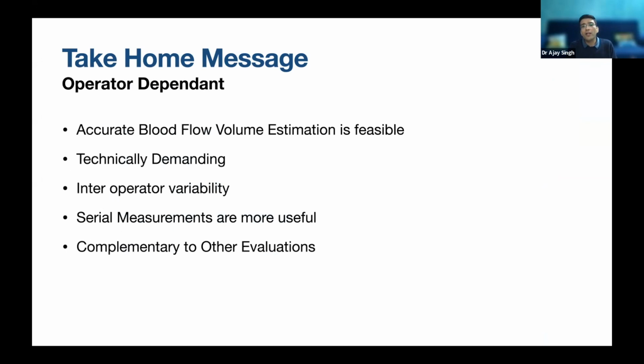And when you are recording this in the patient file, we have to record where exactly you have done this measurement, and you need to keep doing it at the same place again and again to be meaningful. And it is a good way as a complementary to other evaluation which we do for AV fistulas.